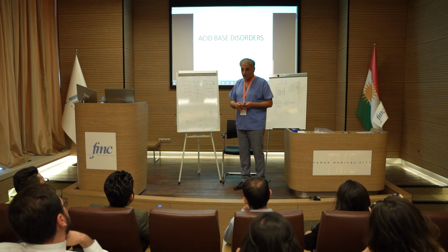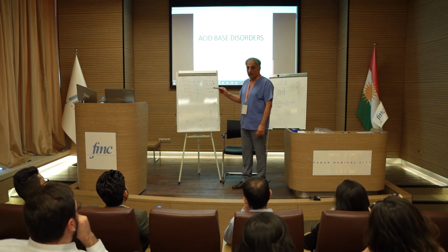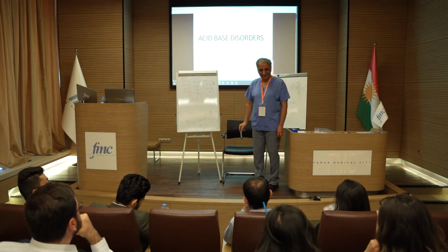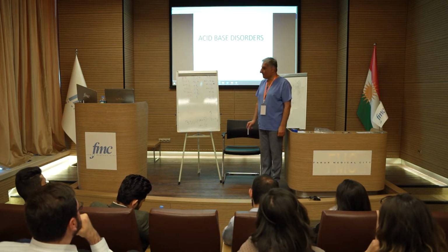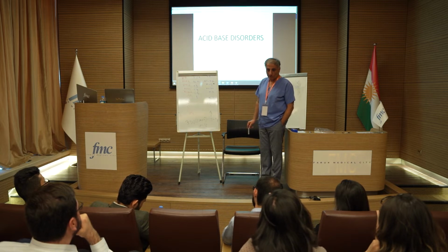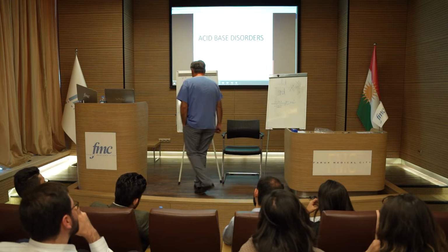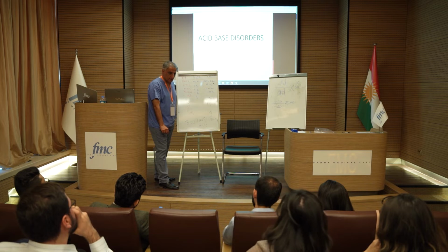Lactate is normal, not a problem, but she's acidotic. The pH is 7.2, so it's acidosis. The PCO2 is low, so it's not respiratory. The HCO3 is 17, so it's metabolic acidosis. It's just the metabolic acidosis.